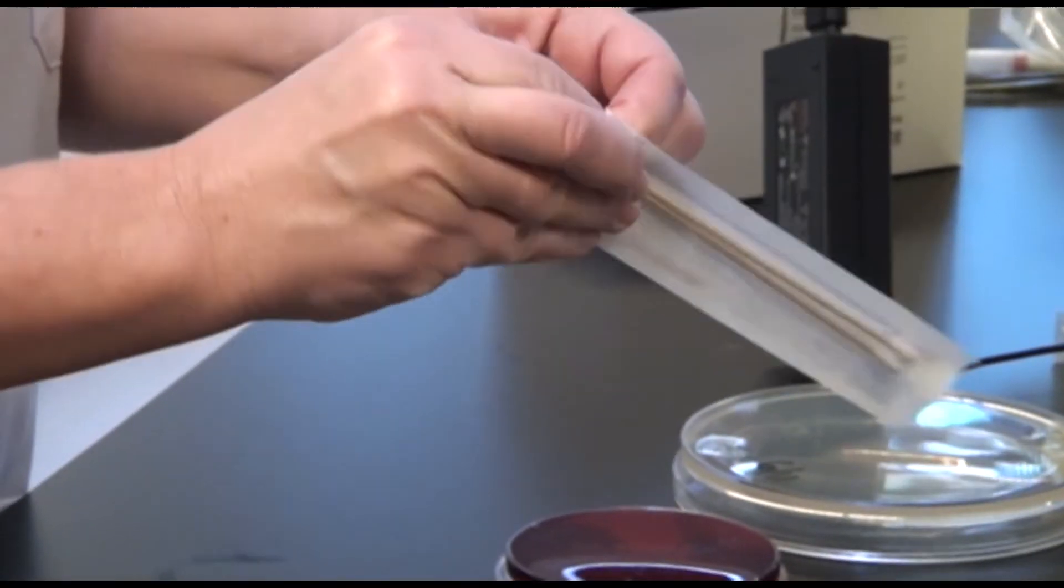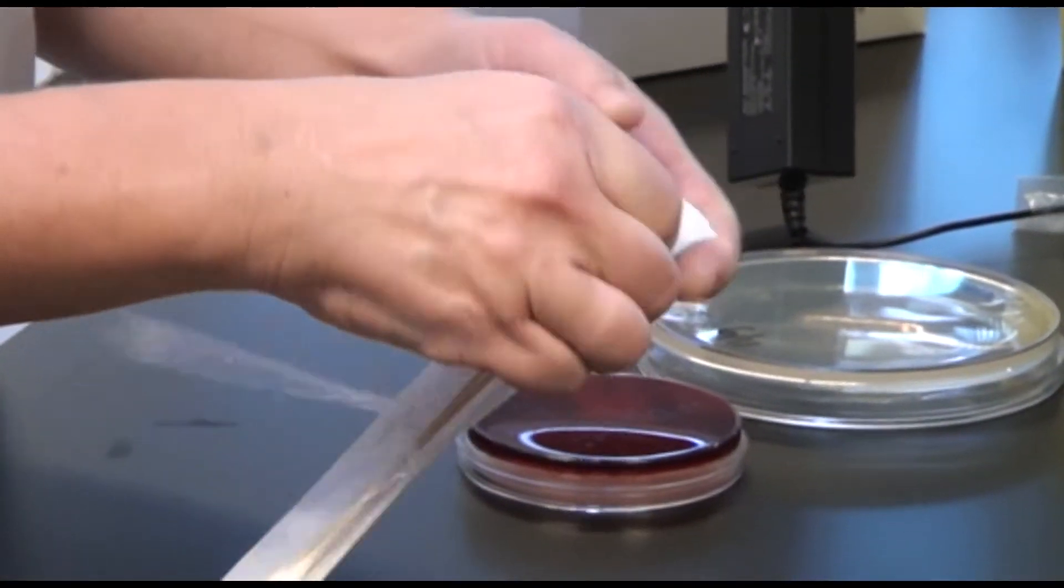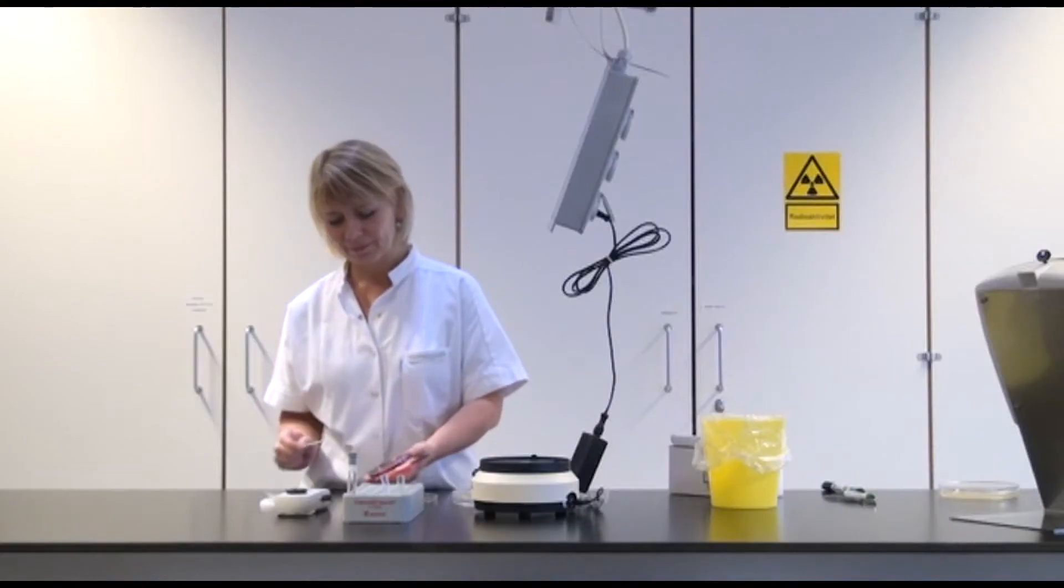I open the sterile cotton swab and dip into approximately 3 colonies on the 5% blood plate.